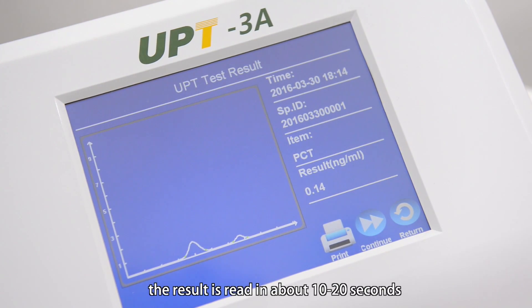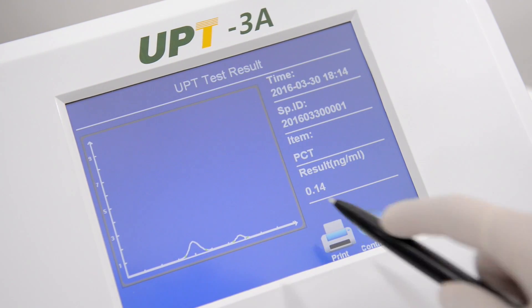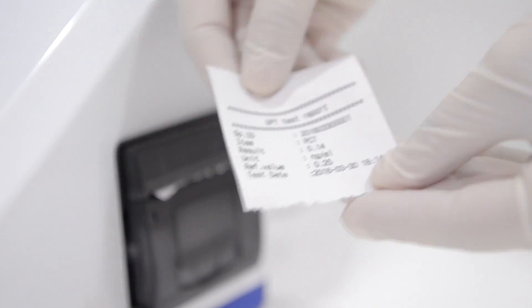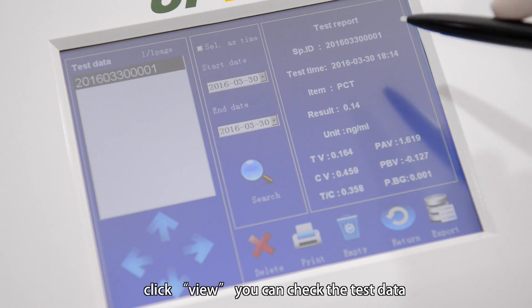The result is read in about 10 to 20 seconds, then the result is shown on the screen. Click print to print the test report. Back to the main interface, click view and you can check the test data.